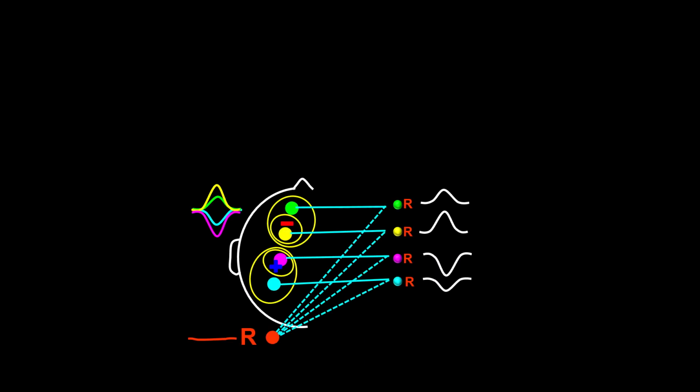In this frame, you can see an isopotential map. This map shows two fields produced by a horizontal dipole with expression in the scalp. And you can also see in this frame its corresponding waves.